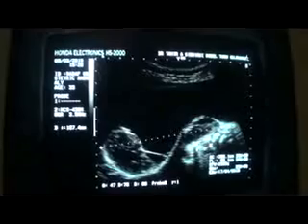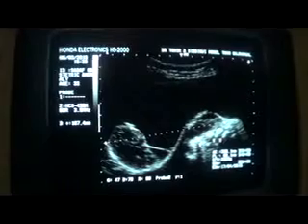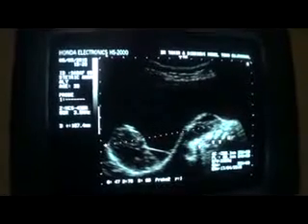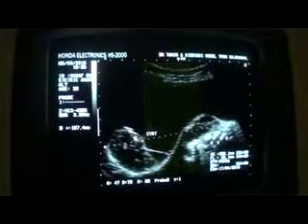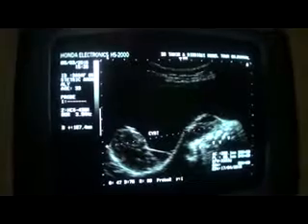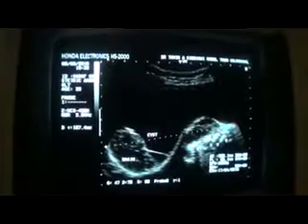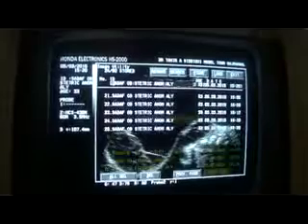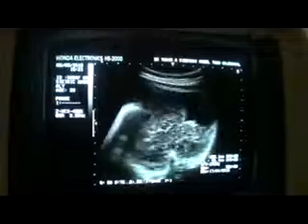So this is a cervical meningoencephalocele, a very large one, and this is the cyst, this is the brain tissue, this is the brain tissue within this cystic area, and thus this is a case of meningoencephalocele with the rest of the parameters seen normal.